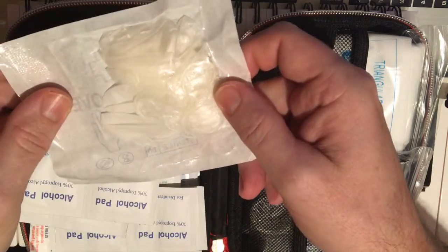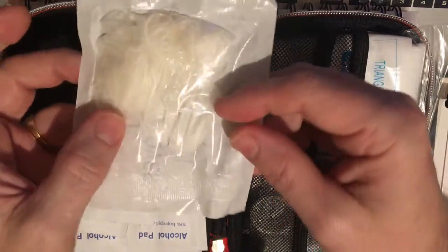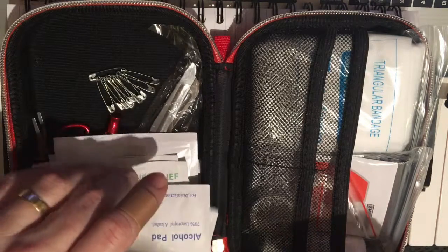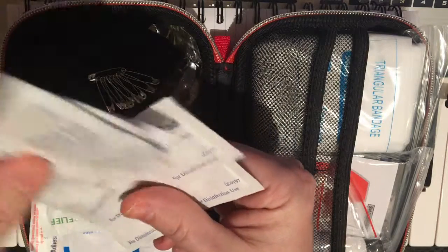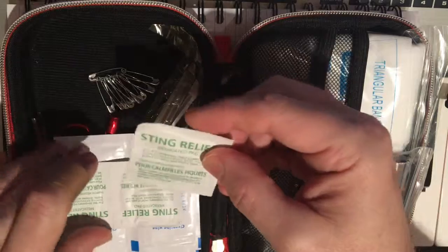We've got a pair of vinyl gloves here. I will probably add additional nitrile gloves — those are my preferred kind. We have alcohol pads, 70% isopropyl — a handful of those, good to have. Sting relief — this is 6% benzocaine and there are about three of those. Very handy if you get stung by a bee or something like that.